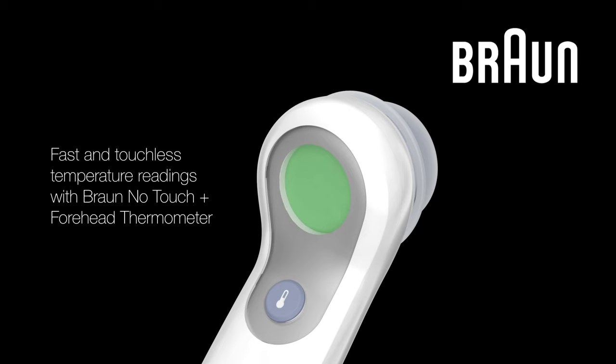Experience fast and touchless temperature readings with your easy-to-use Braun no-touch forehead thermometer.